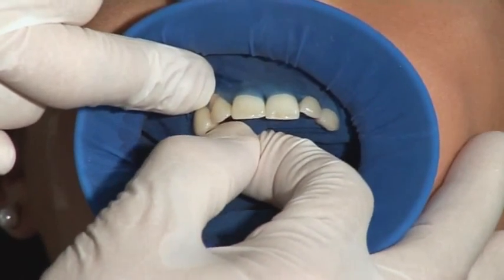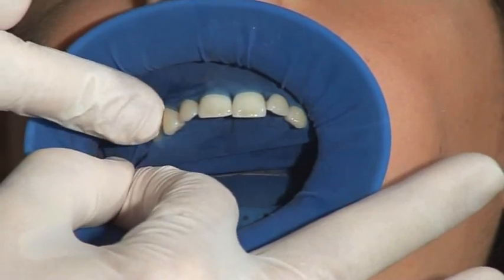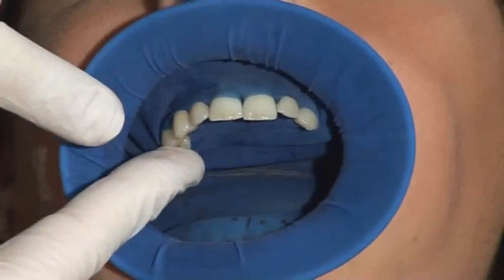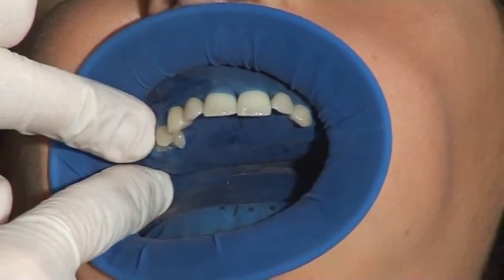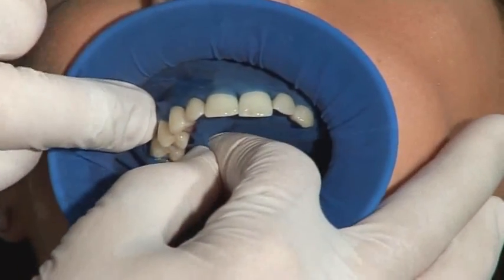Using the same method, continue to pass one septum after the other through the contact points. For enhanced fixation and overview, it is recommended to expose not only the tooth to be treated, but also some adjacent teeth on both sides, even in case of single tooth procedures.